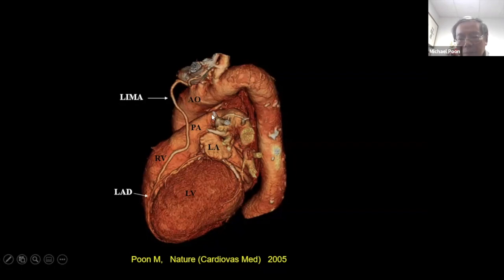So this is something where non-invasive imaging, again, plays a very important role after a surgical procedure, to see whether the graft is working or not, and whether there's some other problem besides the graft causing this. Is it because another blood vessel is not flowing blood so smoothly, which needs to be fixed? So you can see that, again, the imaging is very important non-invasively to make a lot of these important diagnoses.